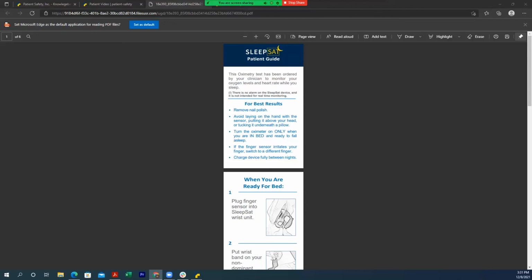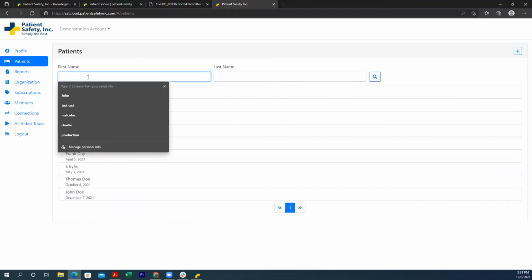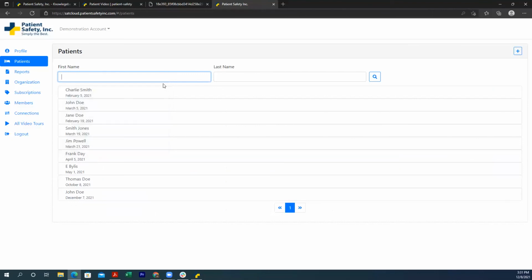I see another question from Jessica Turner. Is there an easy way to look up a patient ID on the download screen? I believe this is related to looking up the patient download in the Connection Center application. At that point, going based only off of the patient ID, there's not a way to search, but you can search using either their first name, last name, or a combination of the two.